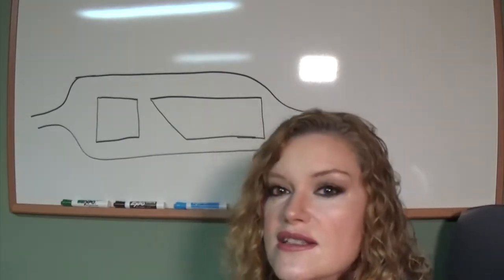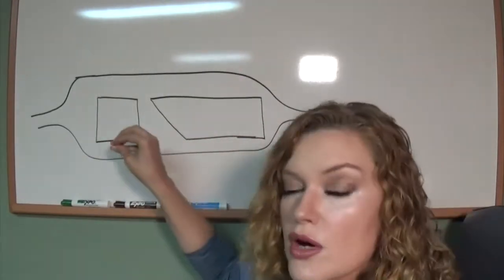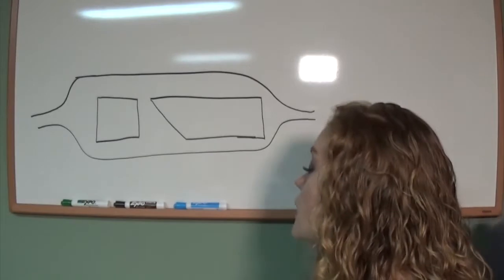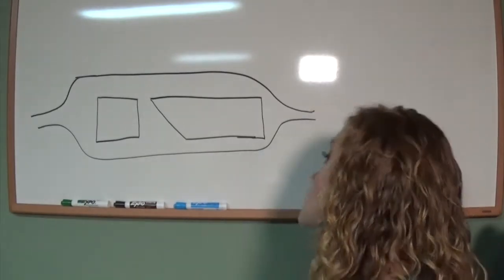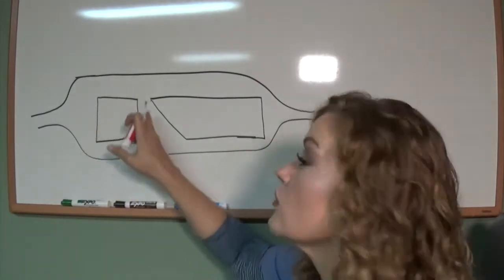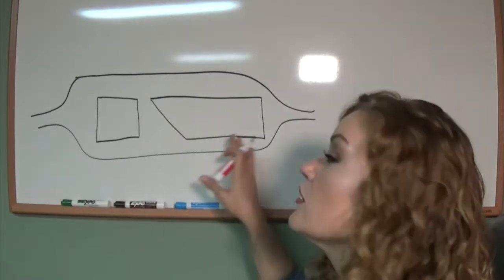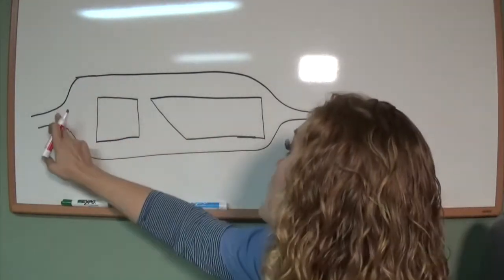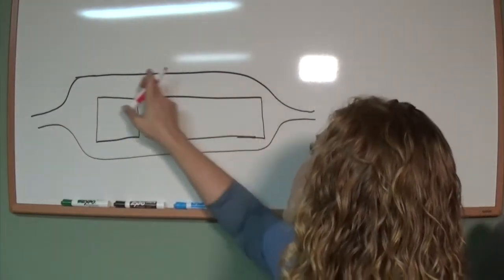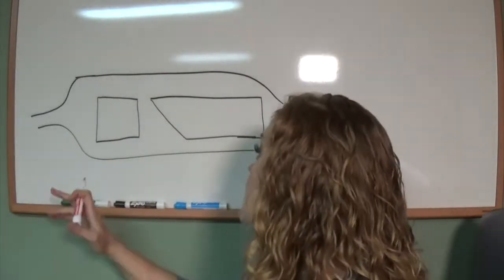Let's talk about the basics and some of the questions that they ask, because there is a lot of little pieces and parts in here that they do ask you about. So when it comes to X-ray production, what ends up happening? Here we have the cathode and we have the anode. And what this is representing, you love my picture, I know, is the glass envelope, and that is kept in a vacuum. You'll understand that in a minute.